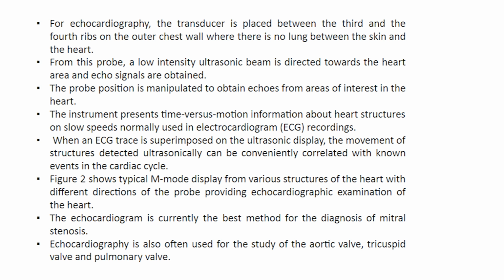The instrument presents time versus motion information about heart structure on slow speeds normally used in electrocardiogram recordings. When an ECG trace is superimposed on the ultrasonic display, the movement of structures detected ultrasonically can be conveniently correlated with the known events in the cardiac cycle.